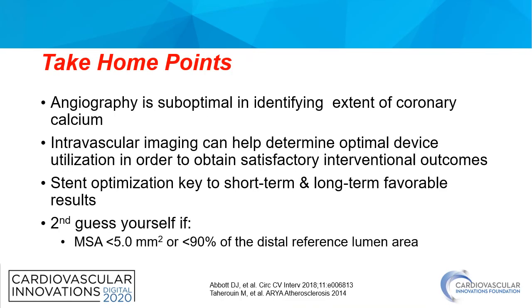I hope I have been able to demonstrate that angiography is suboptimal in determining calcific lesions. Intravascular imaging should be used not only to determine what kind of device to use to treat these lesions, but also to get adequate interventional outcomes.